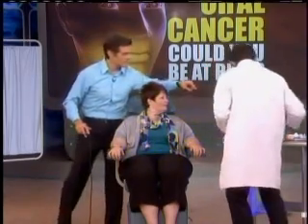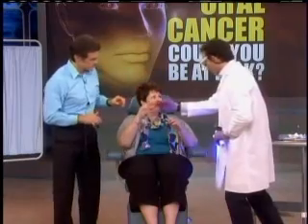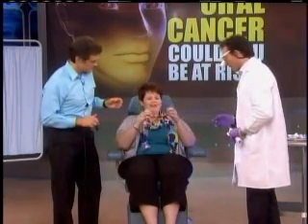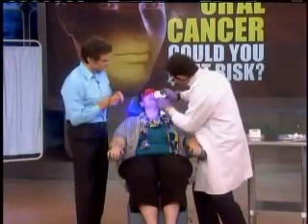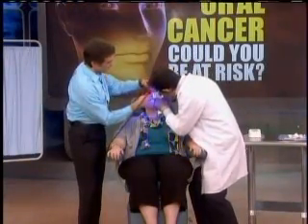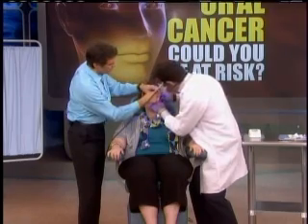What that means is when the cells are just changing from healthy to unhealthy. So let's get your glasses on. We're going to protect those baby blue eyes. Come put your head back for me. Open for me. And we're going to look through. It's a narrow blue light with special filters. And you see the green, the kind of apple green color. That means health. But when the cells start changing a little bit.